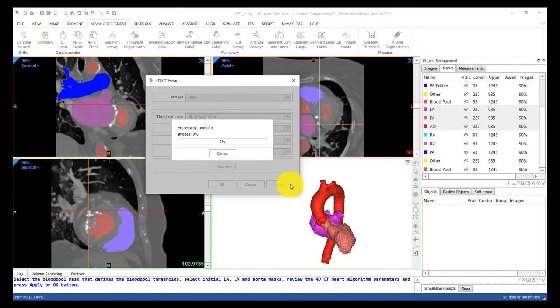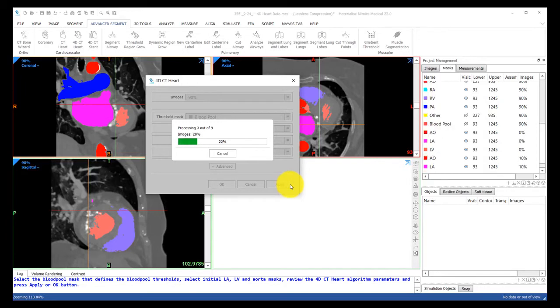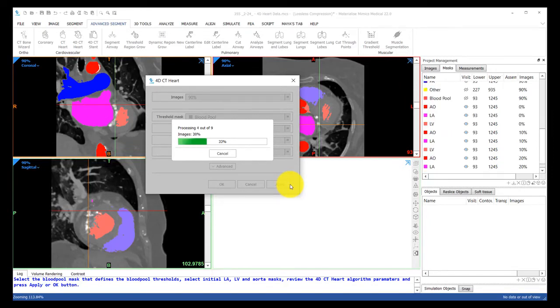Although the tool looks like it only works for the left heart, it actually can be used for the right heart as well, as long as there's enough contrast in your scan. So instead, you can have the RA for the LA position, RV for LV, and PA or pulmonary artery for the aorta position, keeping the full blood pool as the threshold mask.